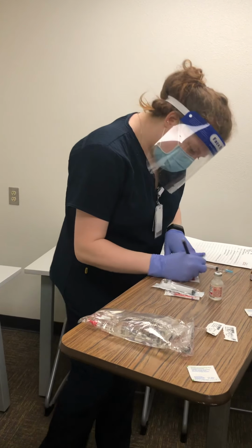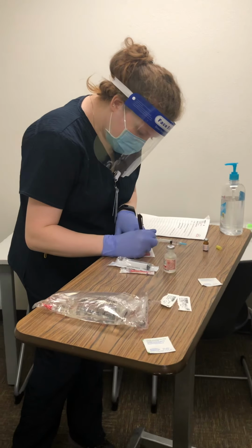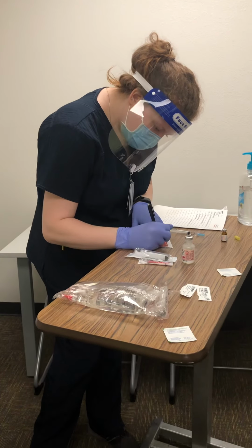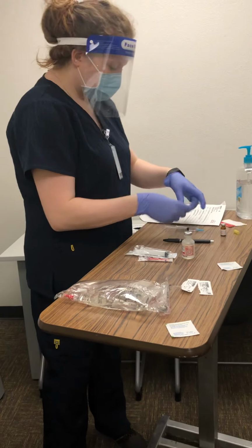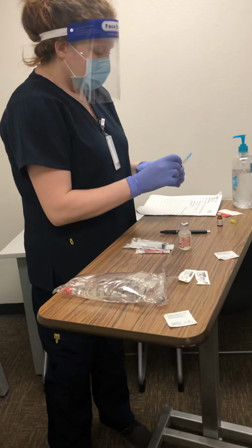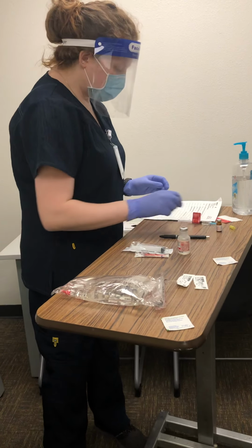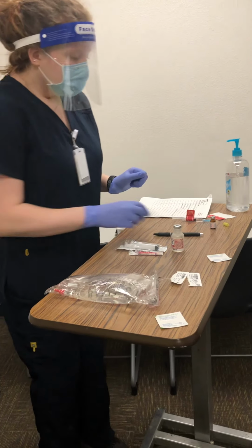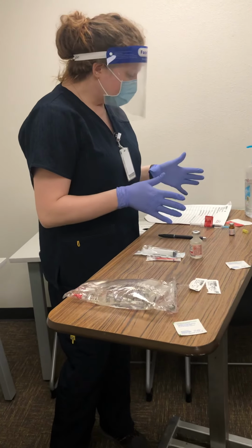Okay, so I'm just going to write my client information, the drug, the amount, and the rest of the information, and we're going to label this right there, below the plunger, put the plunger there, so we can still see where our dose is at. So, that was the first med check for morphine.